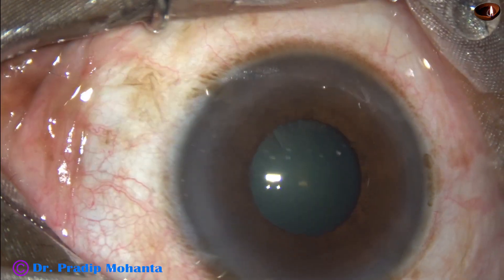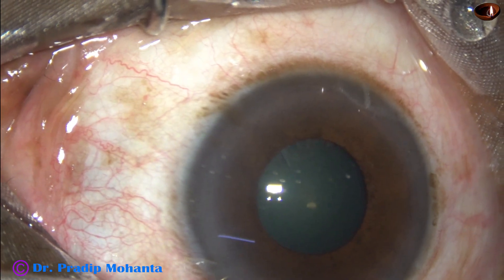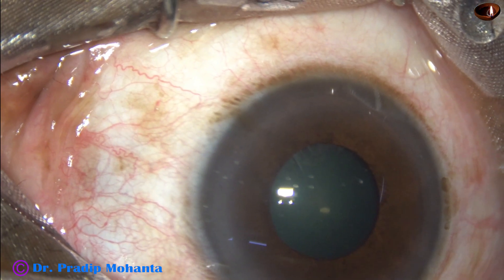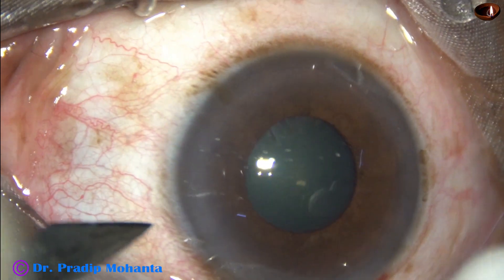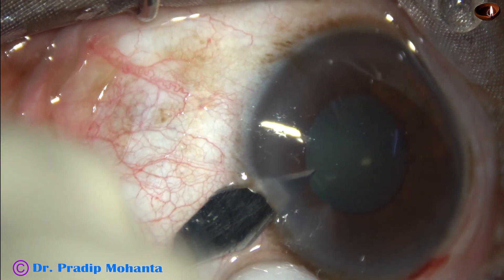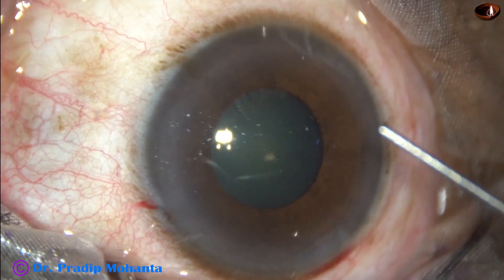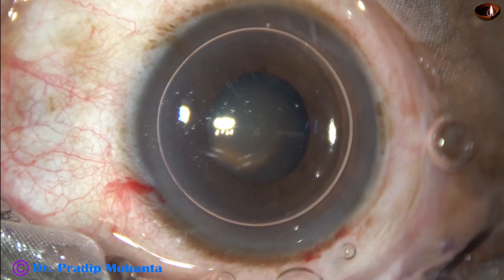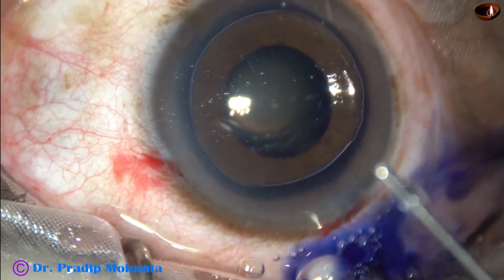This is the main incision on the posterior aspect of the limbus with a 2.8 millimeter steel keratome. Now a side port is to be made. The side port is made by the keratome itself — almost half of the keratome has been introduced. An air bubble is injected and trypan blue dye is applied over the anterior capsule.